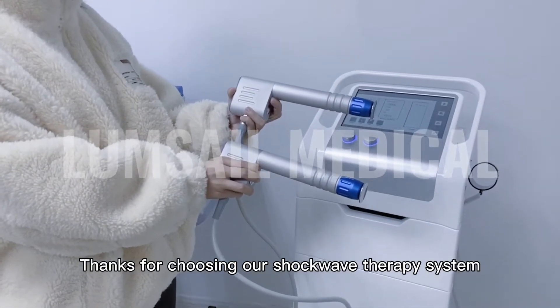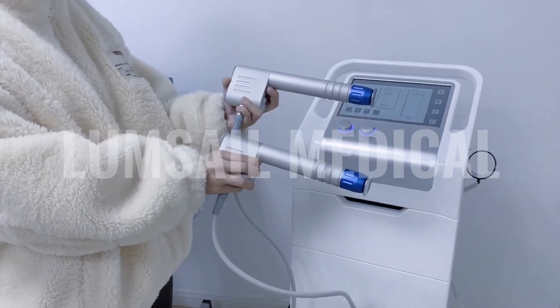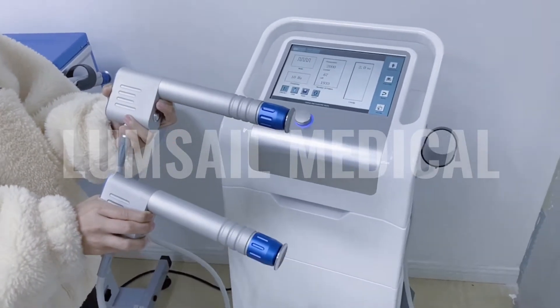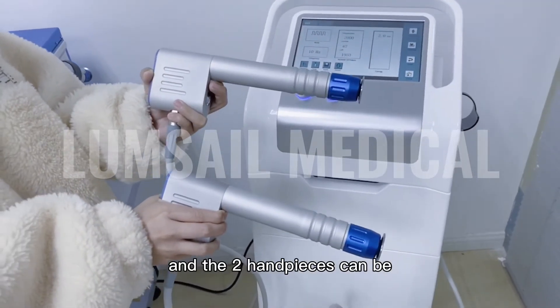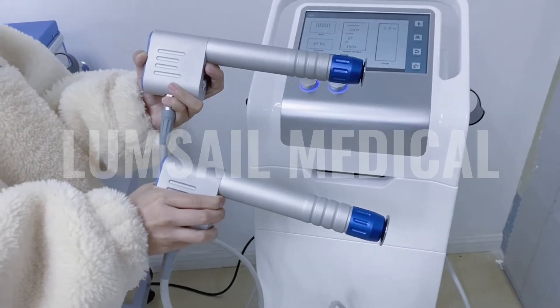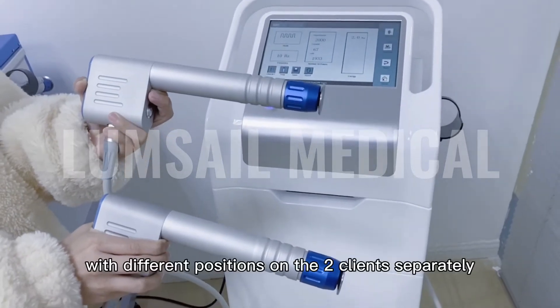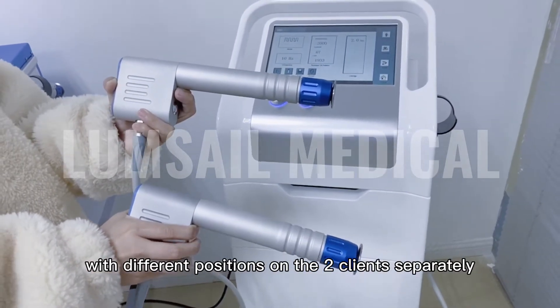Thank you for choosing our shockwave therapy system. This is our new vertical high-energy shockwave system with two channel output. It connects two handle pieces, and the two handle pieces can be working at the same time. You can use two handle pieces on the same body with different positions, applied separately.